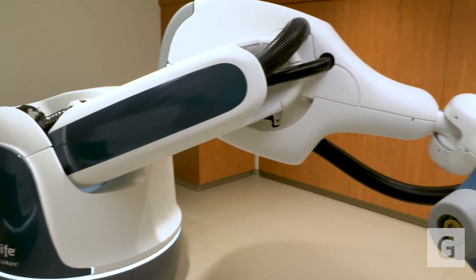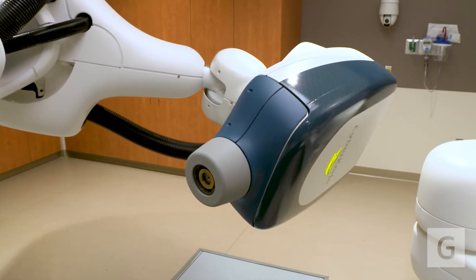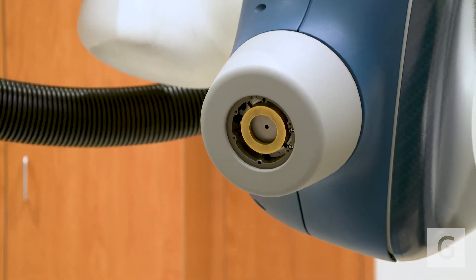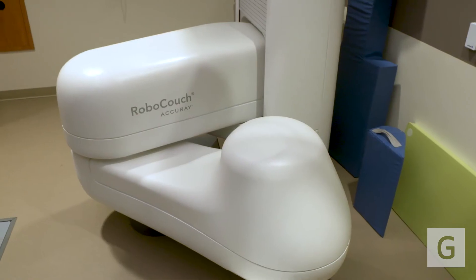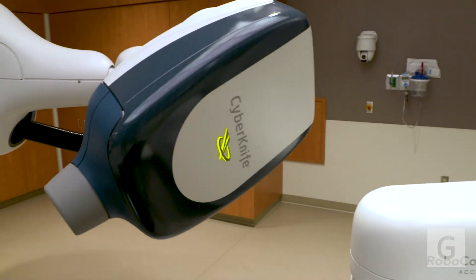In general, the radiation schedules have been able to be contracted because we've found that if we give a higher dose per treatment — as long as we're able to do that safely, and that's the key — we can still achieve the same outcome as far as curing the cancer or controlling the tumor, without having the patient have to come back and forth so much.